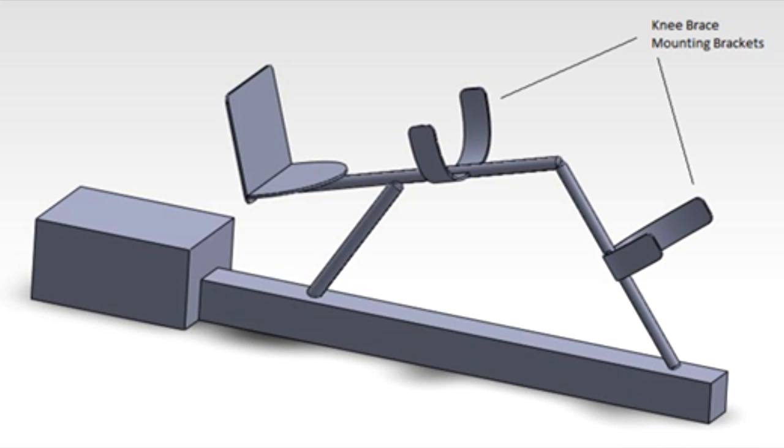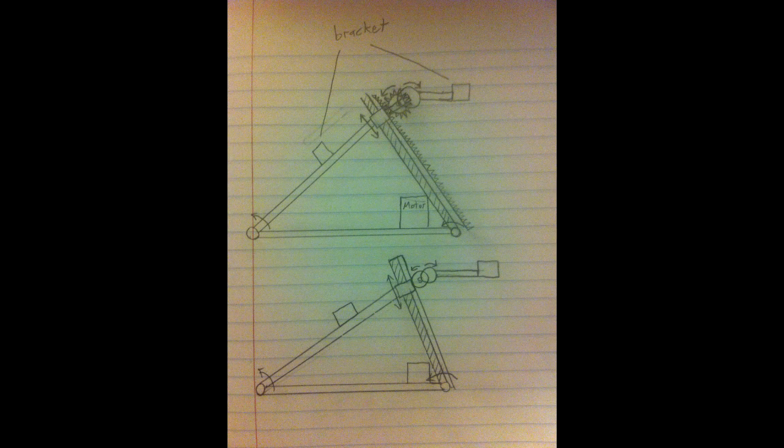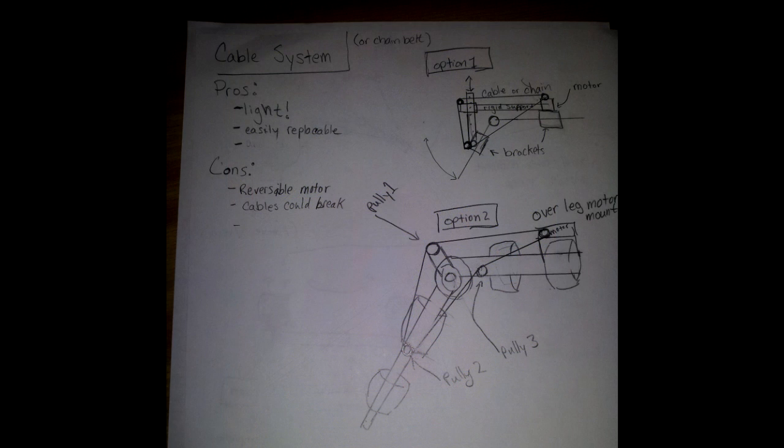When we started planning out possible approaches to our device, we looked into several possible mounting options for the brace, as well as the means for driving the prescribed motion from a motor. We looked into a gear system that ultimately used chain rings to drive the motion at the knee. Another system, using cable tension as the means for motion, was looked at for its lightweight setup.